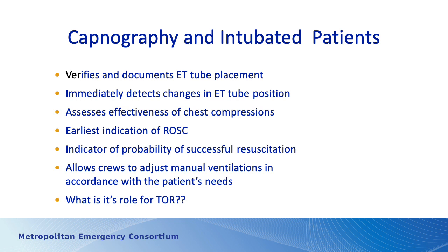We can also use capnography in intubated patients as a way of monitoring the patient's ventilation in accordance with the patient's needs. An easy example is an intubated patient who has suffered a head injury. Years ago, we thought we had to hyperventilate the patient, blow off CO2 to reduce intracranial pressure. Well, that's actually a double-edged sword, and we found that that's harmful to the patient. I'll talk more about head injuries and cerebral edema next month, but we can use capnography in an intubated patient who's had a head injury or a stroke to make sure we don't ventilate too much or too little.